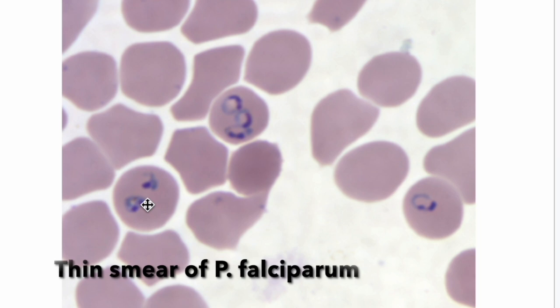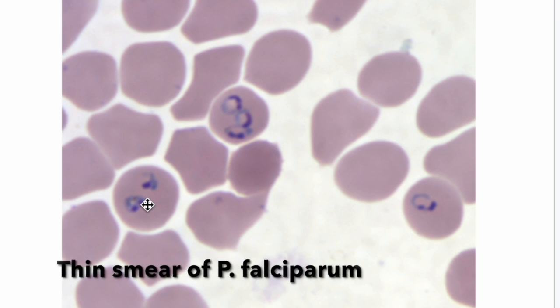So it helps, and having it also provides structural detail of both parasites and infected red blood cells. So here's a look at what would be referred to as a ring stage or early trophozoite. What you see are these darkened chromatin dots of P. falciparum as it would appear in a thin smear. And in this, you're really interested in the parasites inside the red blood cell.